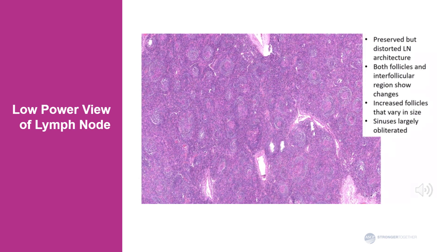This is a low power view of a lymph node involved by the hyaline vascular variant of Castleman disease. The lymph node has overall preserved but distorted architecture. What's immediately noticeable is that you have increased follicles, which vary in size and many are small. Sinuses, which are typically open, are typically obliterated here, or largely obliterated.